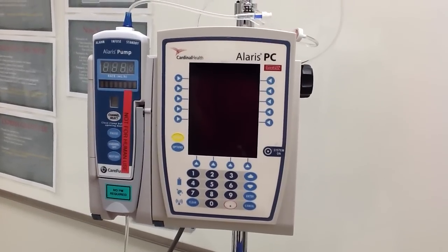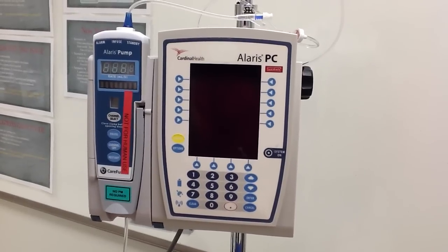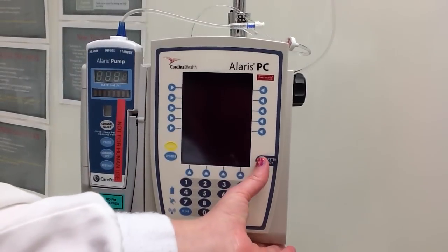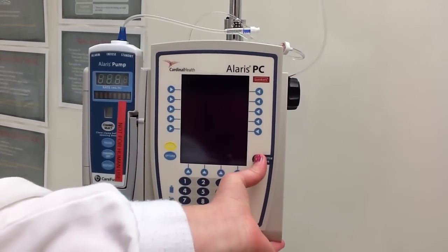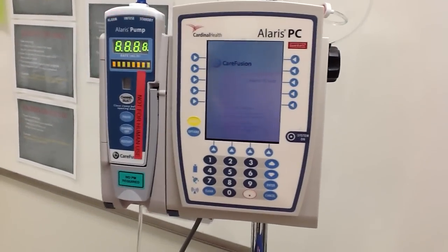This video is to demonstrate how to turn on and operate your Alaris IV pump. We are first going to turn the system on. Once you have pressed it, it's going to do a self-check.